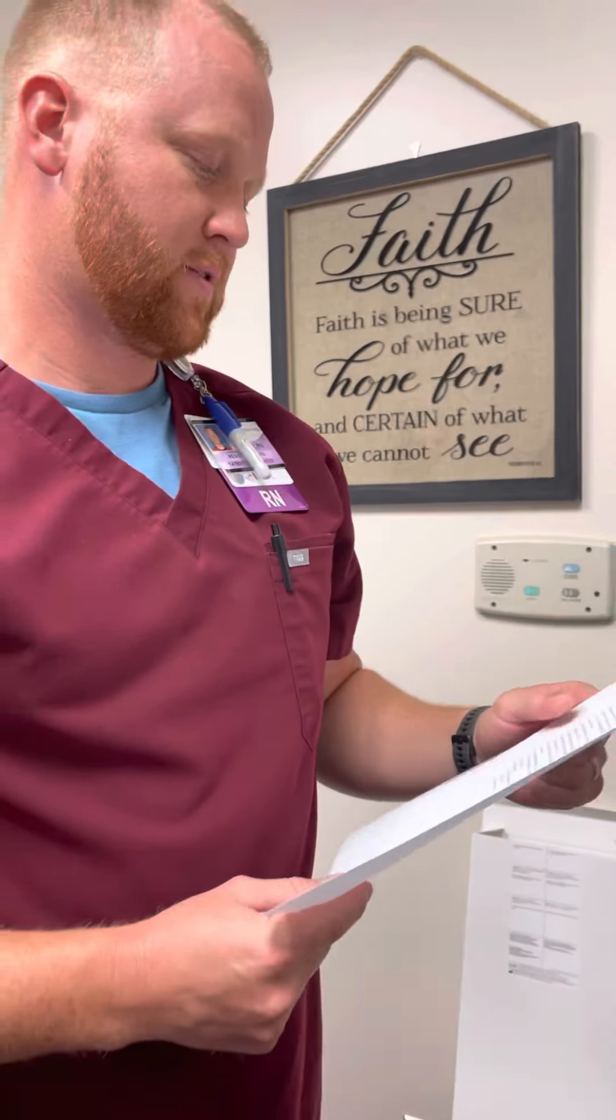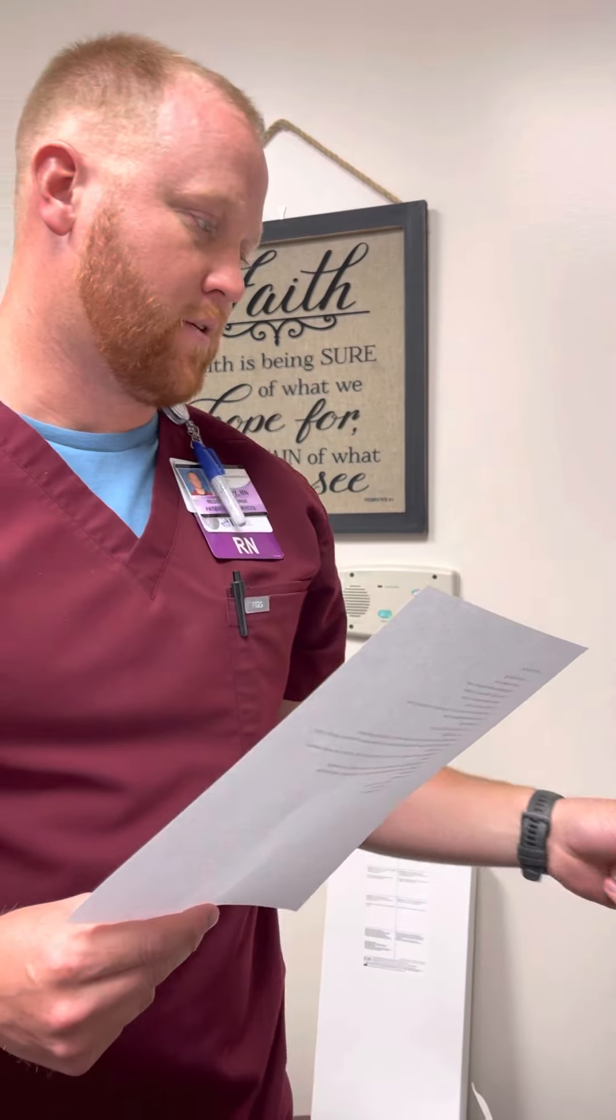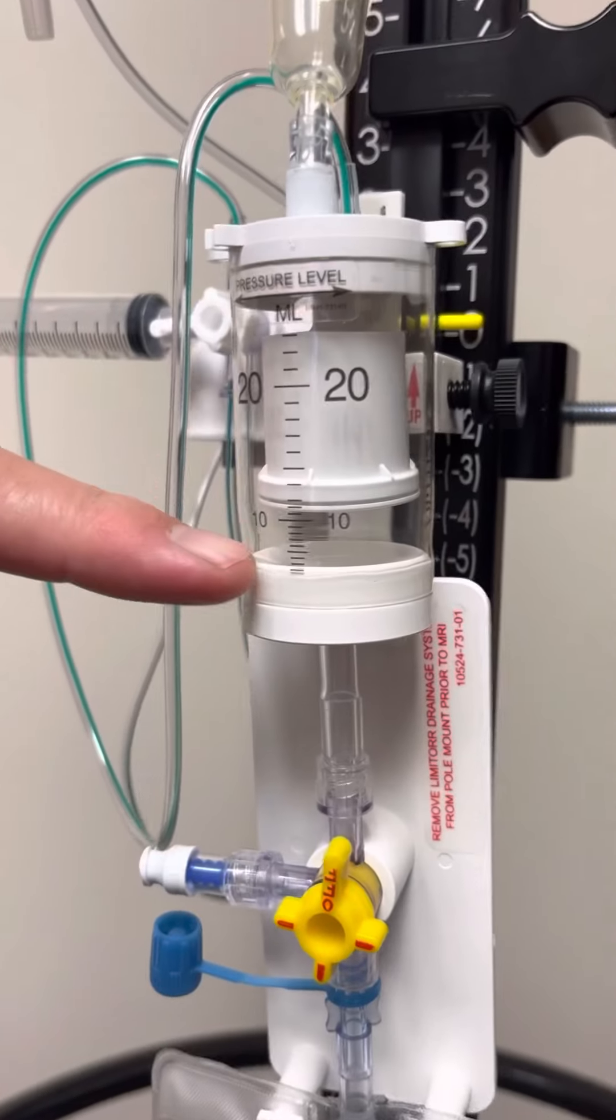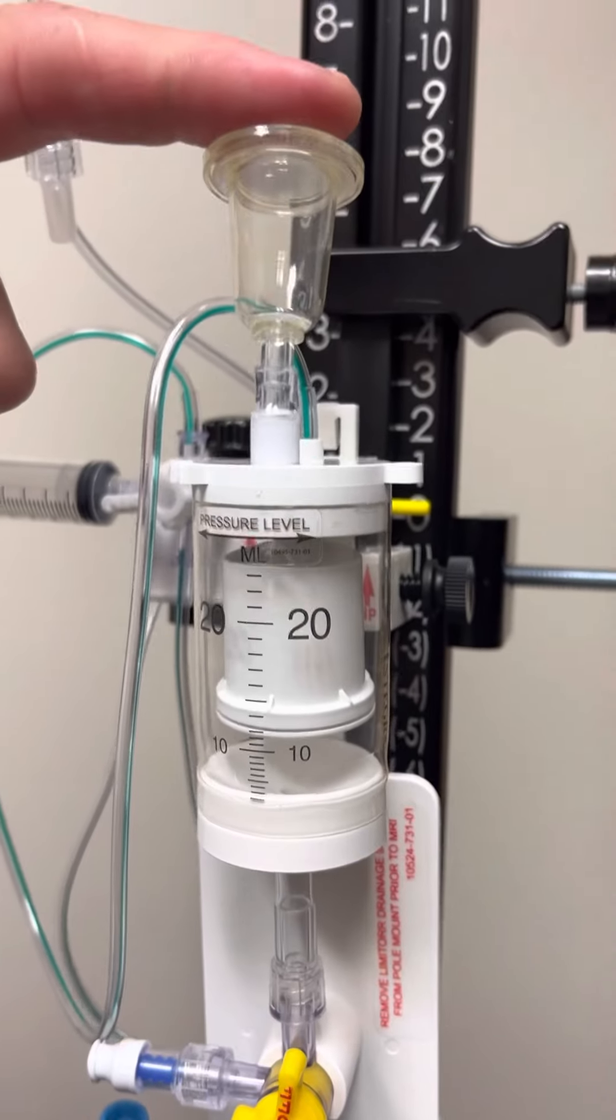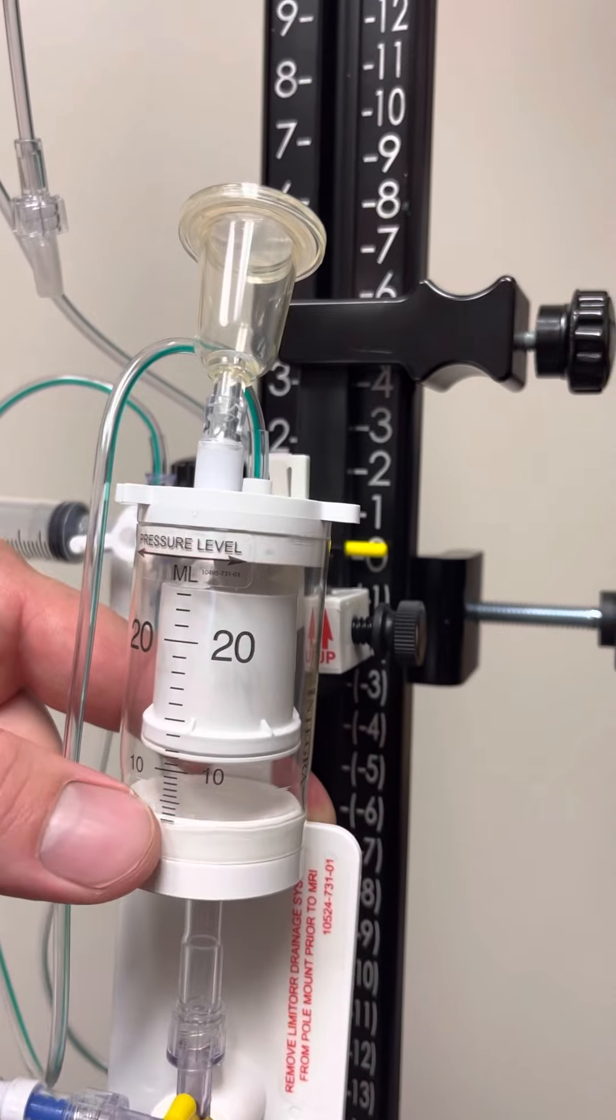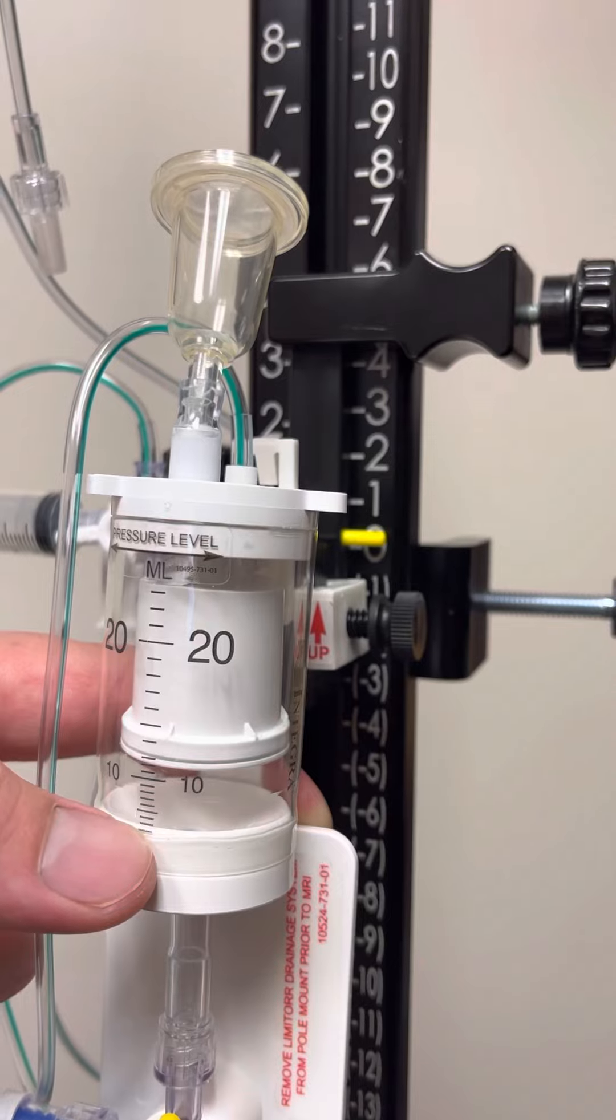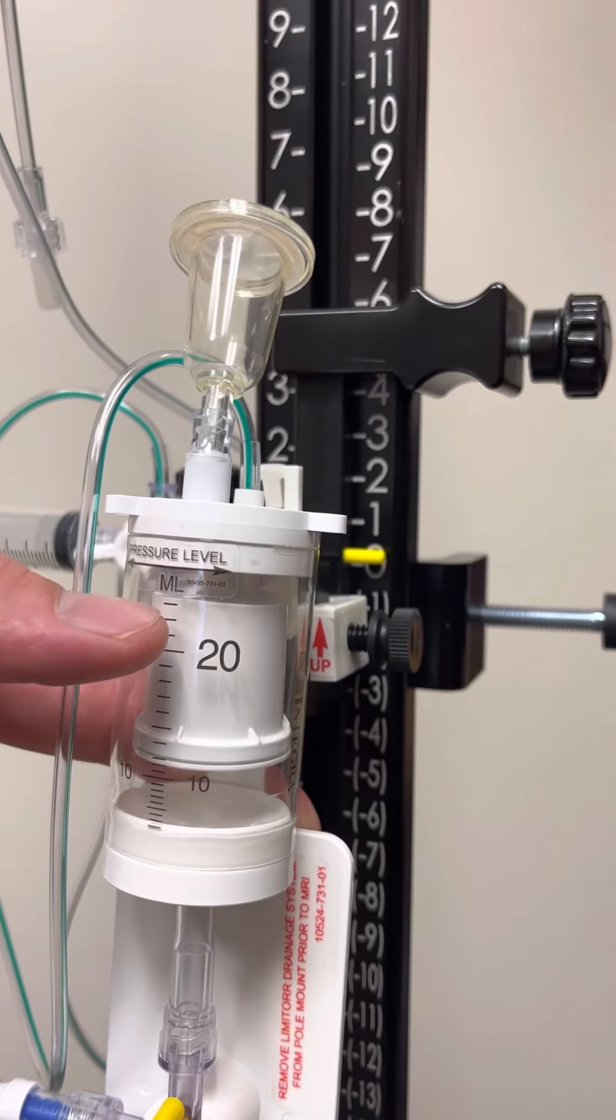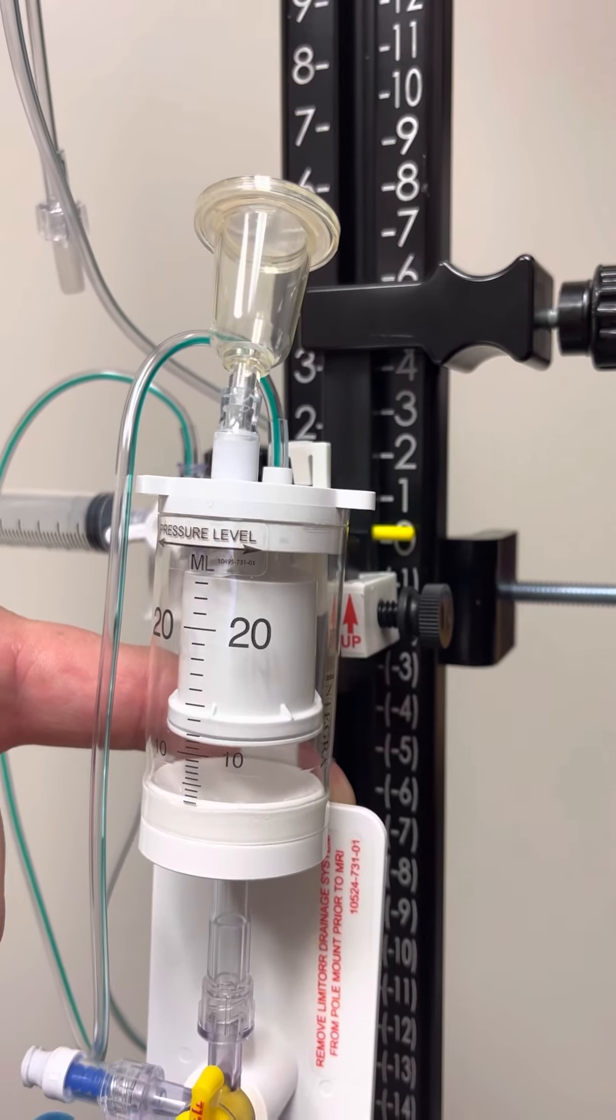Okay, a few key points for the lumbar Limitor drain itself. You will have a specific order of how much CSF to drain per hour. With this Limitor device, if your order is to drain 10 cc's, then you would need to prime this burette up to 13. That would allow it to go up to the maximum amount of 23, which would give you your 10 cc output.